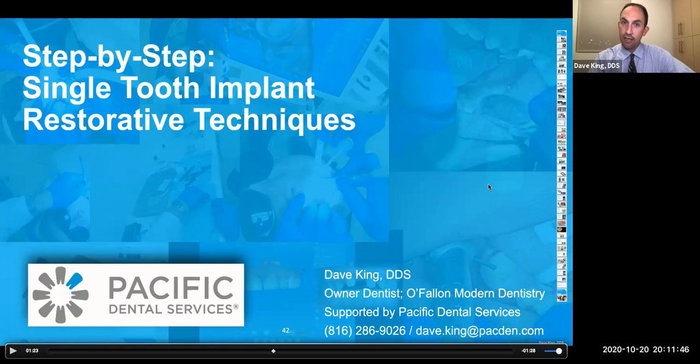As long as, again, the occlusion's managed and you're following protocols, I think generally more is better, but to a degree. You get to a point where there's diminishing returns as you add more implants. For any type of fixed prosthetic, 4 implants is kind of the entry level. Usually 6 is the sweet spot where most surgeons and periodontists will feel the most comfortable. I don't know that adding any more than that is better.